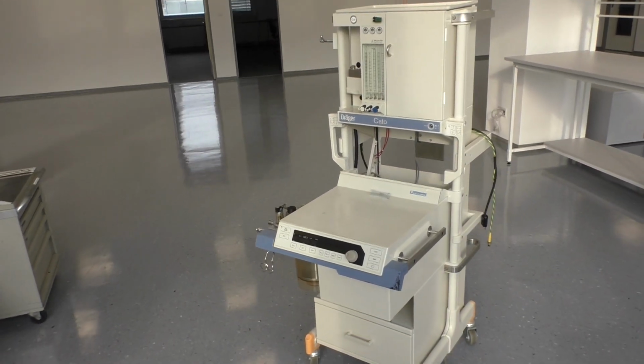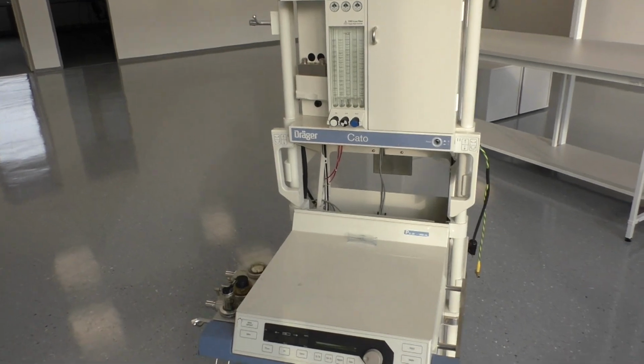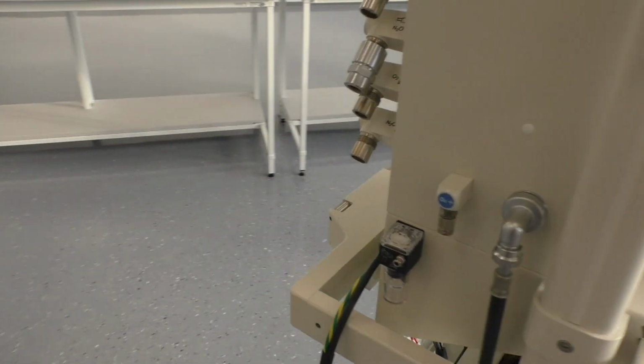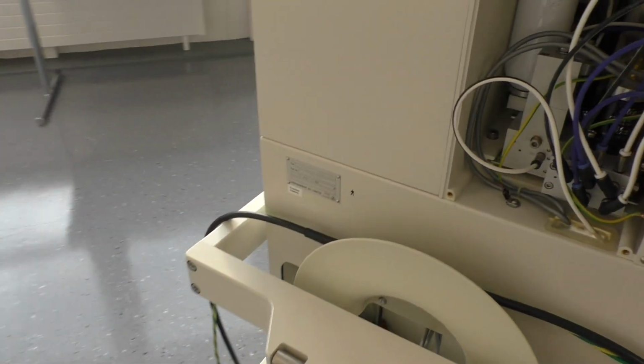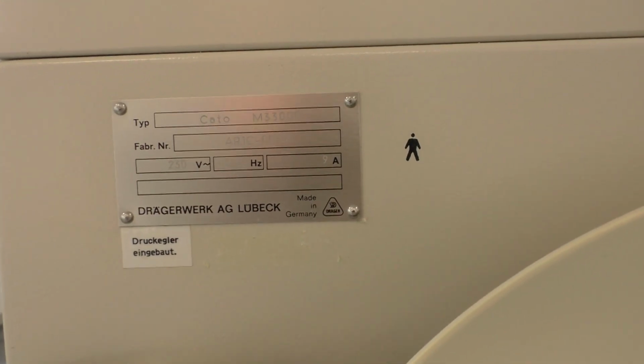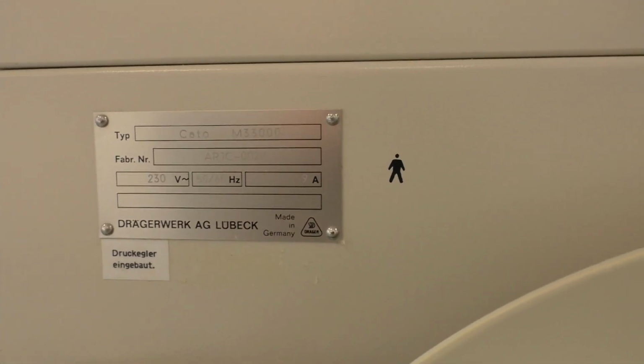Today I have some medical equipment here. It's a Draeger Cato Anesthesia Ventilator. That's how this thing is called. It's the model number M33000.